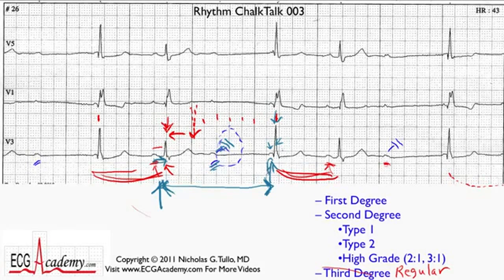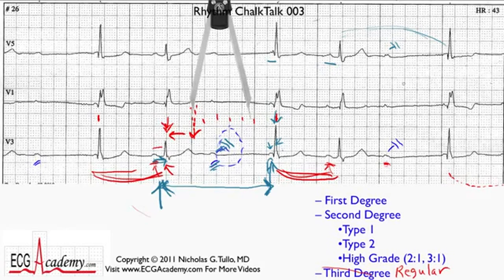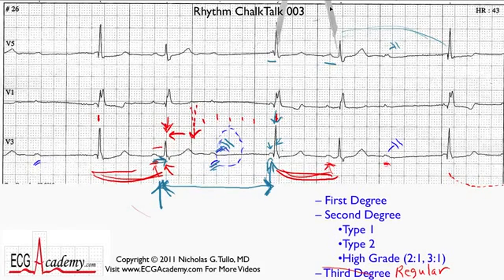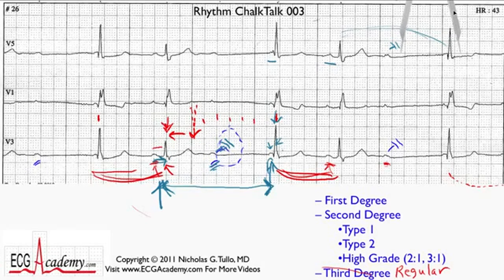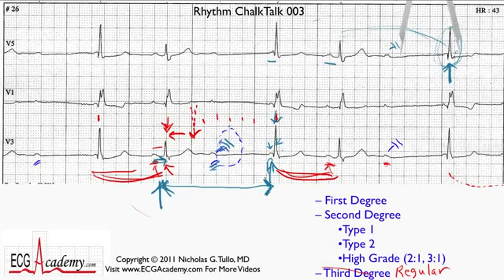Some people would look at this and say, this must be type 1 second degree AV block because the PR is short and then it gets longer and then it blocks. And someone might say that if the pause is less than two times the previous R-to-R, that must be Wenckebach. But the answer is wrong, because this is one of the exceptions to the rule. This QRS complex is in fact not conducted — it occurs earlier because the focus in the conduction system fired prematurely, breaking the Wenckebach rule.